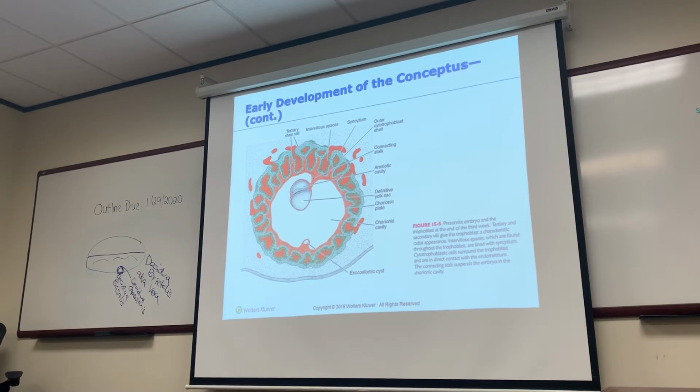Here's a yolk sac that tells us that we have an IUP. This is the chorionic cavity, also gestational sac, also extra embryonic coelom. Now, inside of this, I have the chorionic plate. The chorionic plate goes all the way around. The amniotic cavity is what's going to hold the baby, and eventually it will fuse with the chorionic plate.